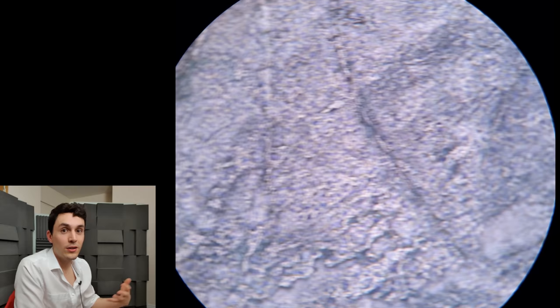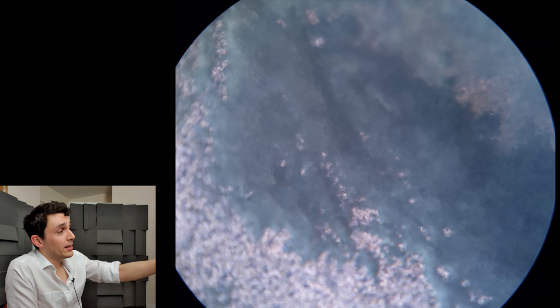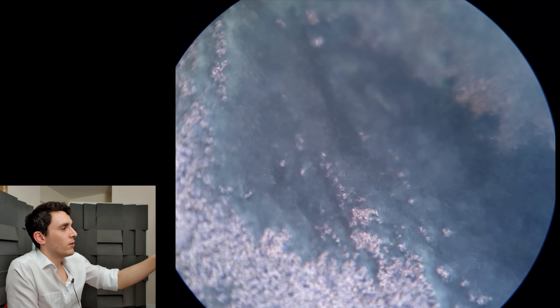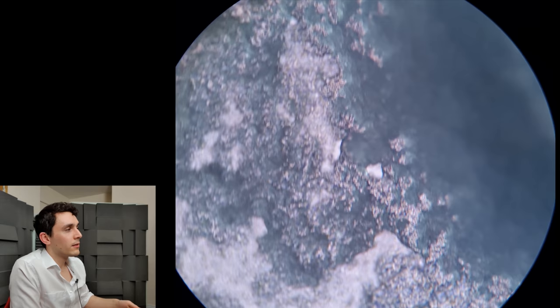Again, more dead skin. This really doesn't look like much. Again, a little kind of hair there — I wonder what that is. This is just thick dead skin on the microscope slide where I didn't slide firmly enough, so it's kind of caked on where the potassium hydroxide hasn't dissolved anything. But we will get to a thinner smear and you'll see the slide suddenly becomes very clear and you'll see what's left behind.